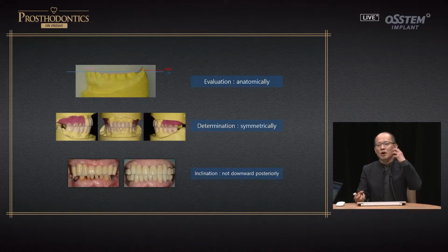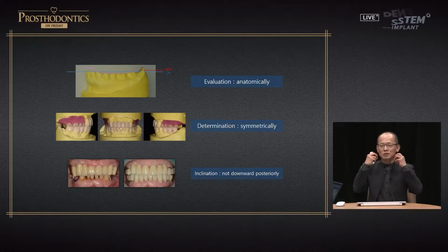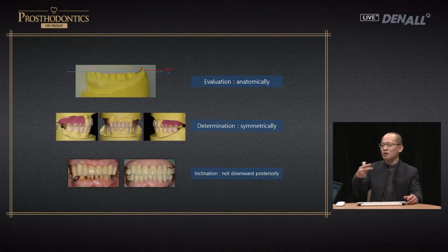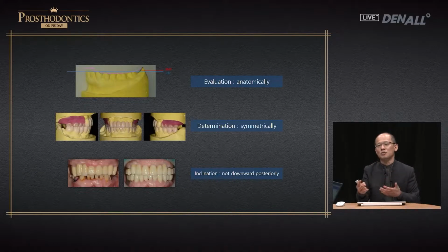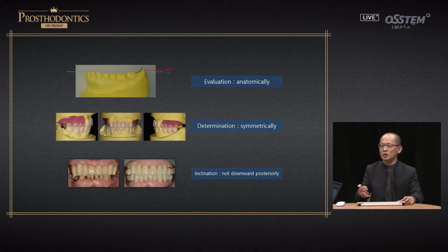Now, if 6 and 7 are missing, you leave that be and then think about the occlusal plane. I can understand that because you would have to remove the implant and create a new one. So you just let what is already there be. If the VD is increased, then the posterior goes a bit lower. Then on the posterior side, you have to always adjust. Otherwise, you have a lot of porcelain fractures. If you see the bottom image, you have all the fractures, and on the posterior there's an implant, so you have to be watching out for that.